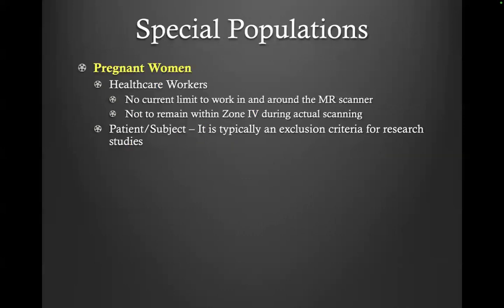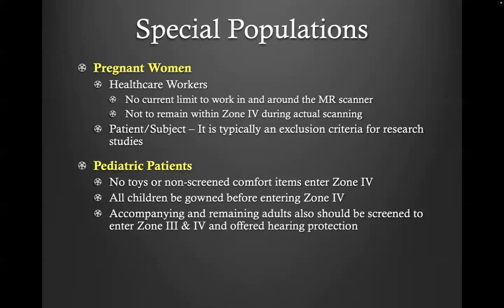What about special populations, for example, pregnant women? For healthcare workers, there's no current limit on working in and around the MR scanner, but you are advised not to remain within Zone 4 during actual scanning. For research participants, pregnancy is typically an exclusion criterion, but for patients, when we have a risk-benefit assessment in place, we do scan pregnant women all the time.